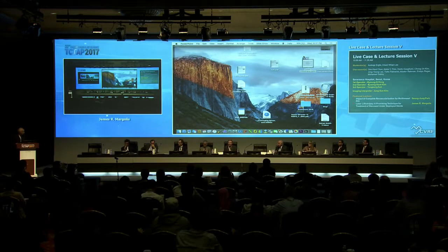Okay. When do you stop? When do I stop? Yeah, when you put the laser, you make chaos, and then open it. How are you sure that you have finished the job and you're going for the balloon? Well, certainly I use IVUS controls, but the key is being able to fully inflate the balloon inside the artery. If I don't have a full inflation of the balloon, then I'm... it's called laser lithotripsy.